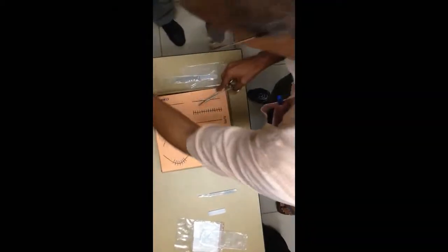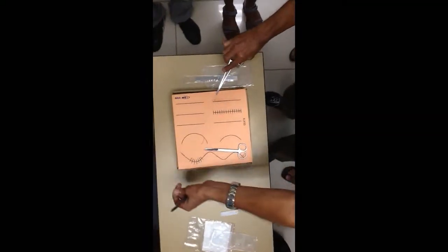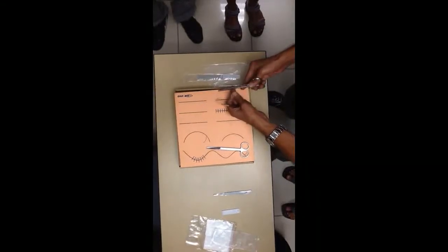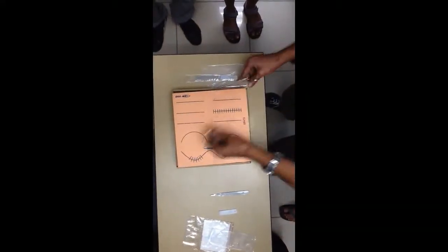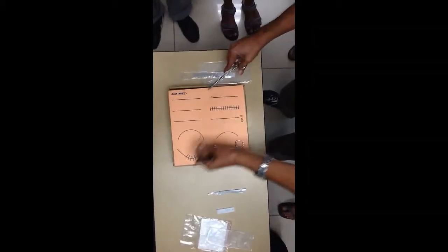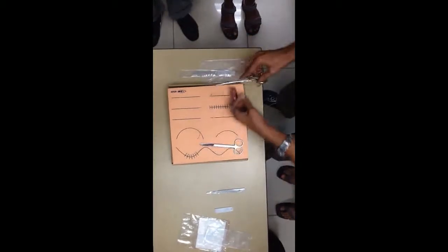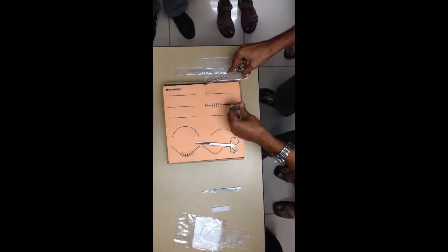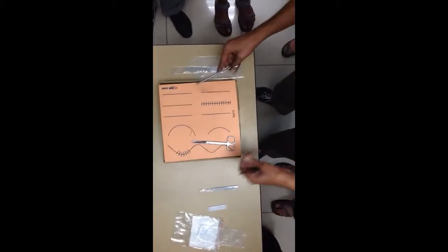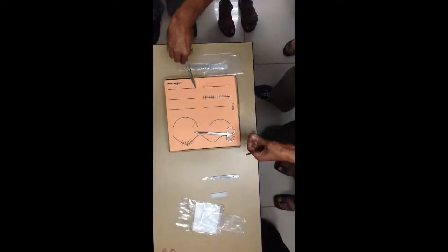See how quickly silk tends to slip — silk is notorious for slipping. Nylon and similar materials do the same. Make sure we have taken multiple throws so that the knot is firmly embedded. What would you recommend for the silk? This is actually nylon, not silk. So after you've taken multiple throws and firmly embedded the knot, in actual practice the end I'm holding now — we just put an artery forcep on it and put it to one side.